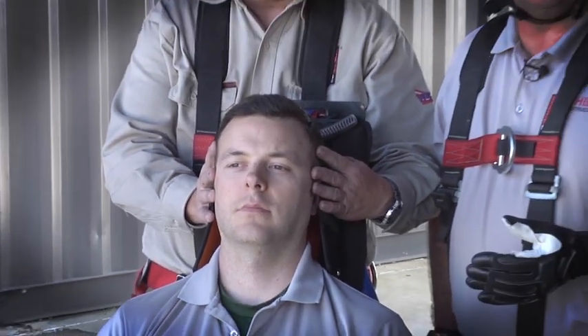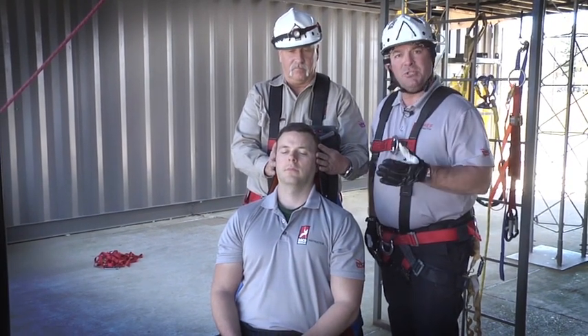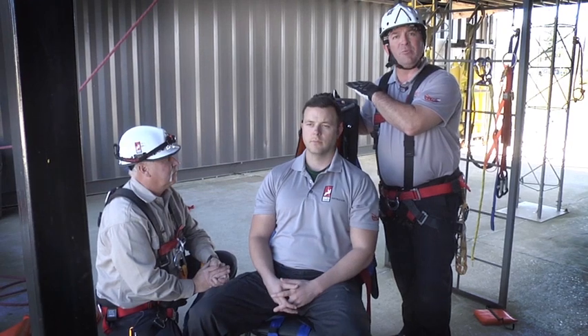Now let's talk about proper body position and application of the SpecPak. When you start your C-spine, always be sure to follow your local protocols. The rigid plate up here should be above the patient's head — this is going to offer great protection when we're dragging the patient through confined spaces. Also, for patient comfort, we want them to be up high in the device.